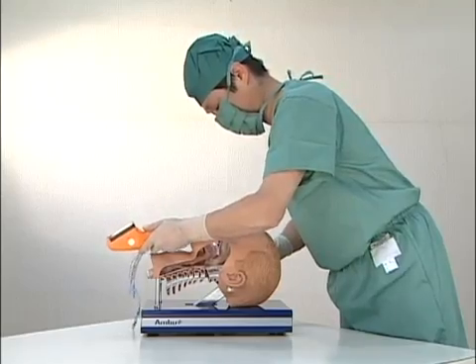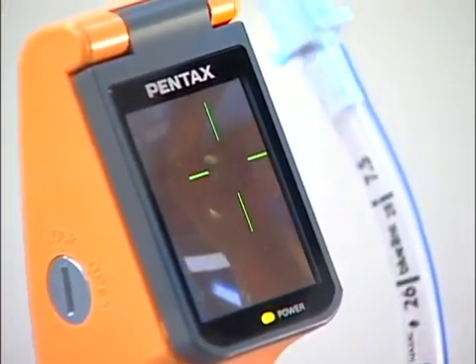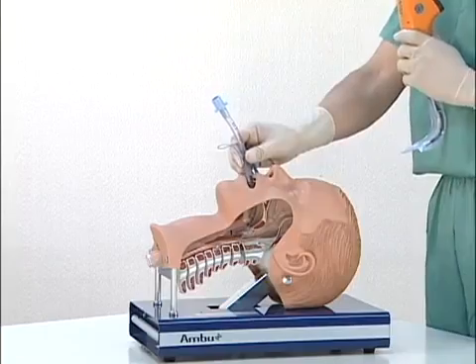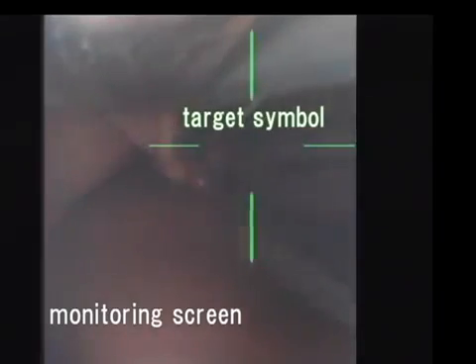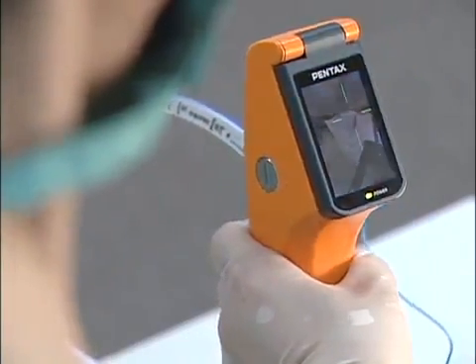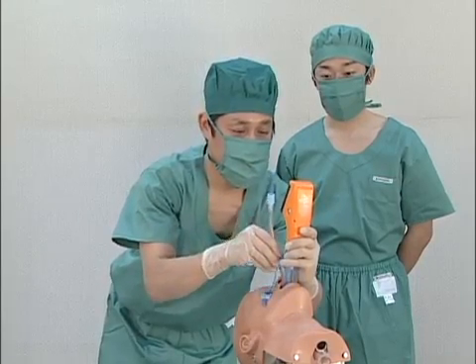With Pentax AWS, you can perform a tracheal intubation without extending the patient's neck while verifying progress on a monitor. Pentax AWS can be manipulated by less experienced operators using a target symbol on the monitor. The monitor has a wide viewing angle, which allows viewing from behind and beside the operator, letting others monitor a tracheal intubation.